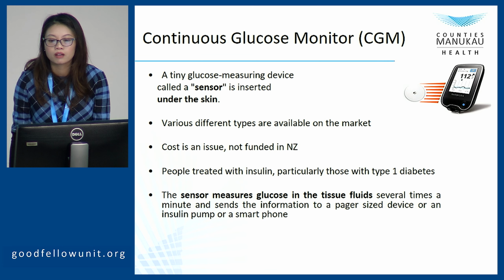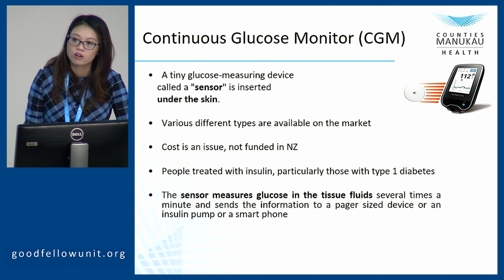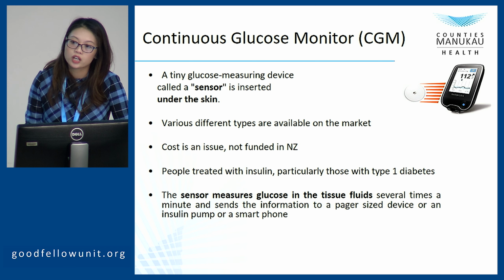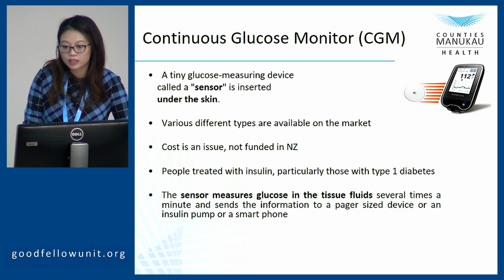And we also have continuous glucose meters available. We call it a sensor, which is inserted under the skin. Later on, Dr. Zhang will talk about it in detail. Because cost is an issue, it's not funded in New Zealand. Generally, it's more beneficial for patients who are on insulin, particularly those with type 1 diabetes.